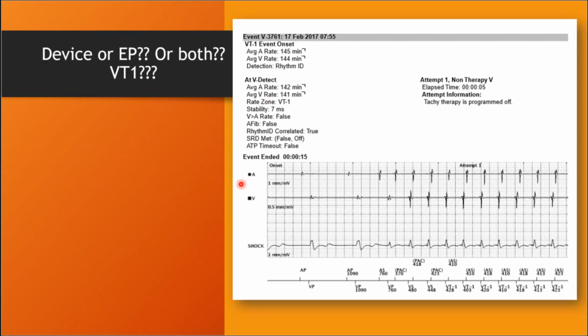And if we look at the A-sense lead and the V-sense lead and the marker channels, we see that it starts with an A-pace beat, a V-pace beat, that's okay, another A-paced and V-paced beat, that's okay. And then a tachycardic episode starts. And what does it start with? An atrial premature beat. And then actually a run of a few atrial premature beats. Now the first atrial premature beat is actually V-paced.